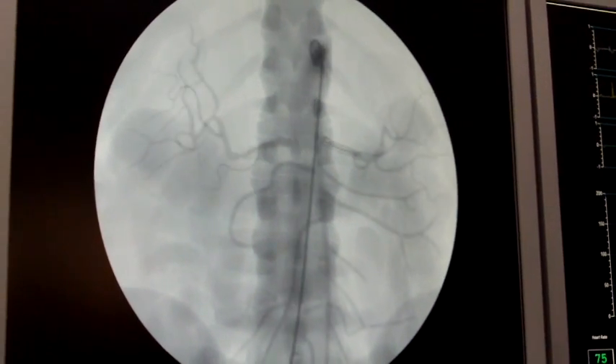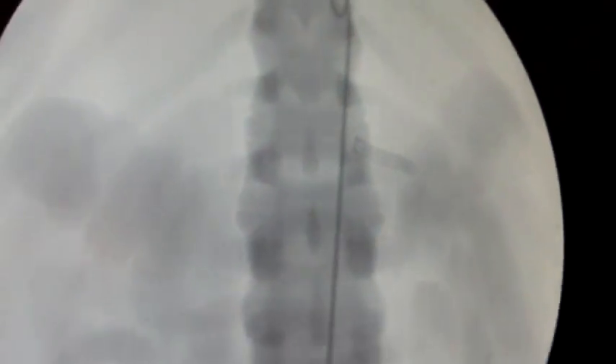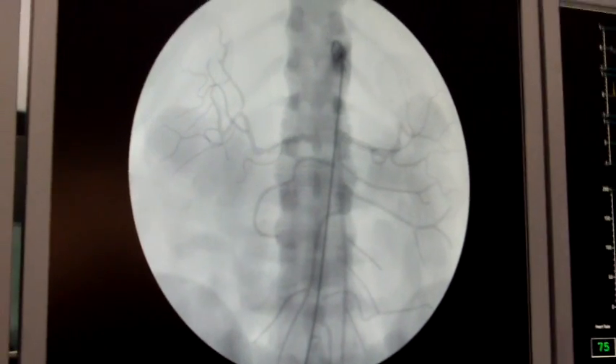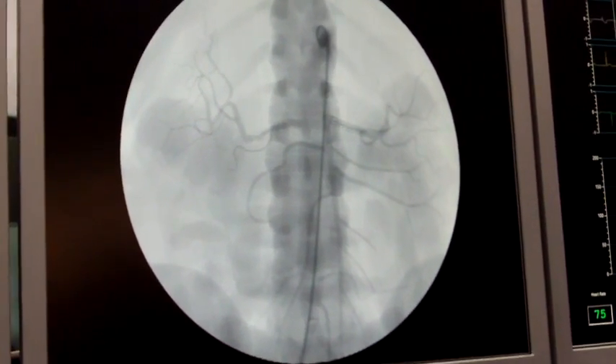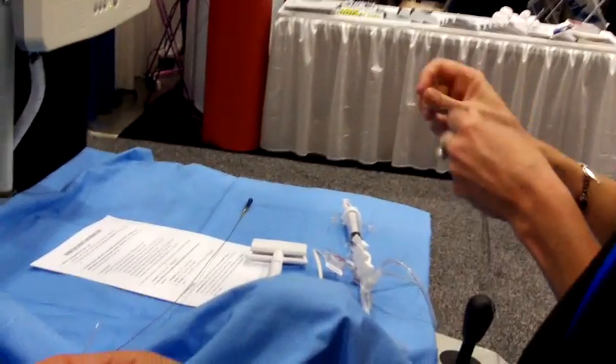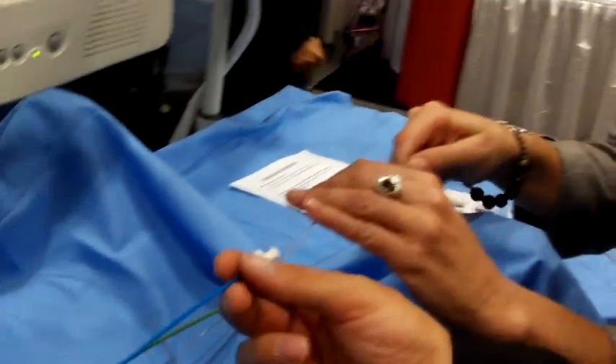They already have a stent — you see on the right-hand side the stent there? But they have narrowing in the other kidney. So we need to go into that other side. We're going to fix it — see it's all lumpy and bumpy over there? We're going to put a stent in over there. This is where you're going to get to maneuver the wire. We're going to put the wire back in there.